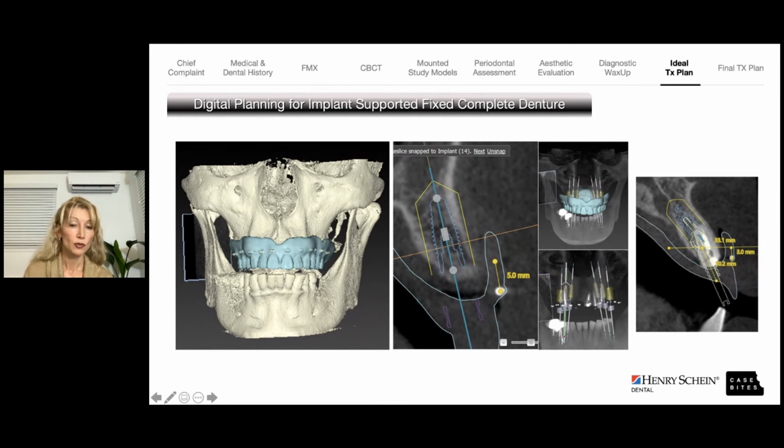And the reason is 2 to 3 millimeters for the soft tissue above the implant, and then another 2 millimeters for that restorative material, the pink material, just to give us a little bit of a cushion in terms of the patient showing any margins at any point. So now that we have that information on a CT scan, we can plan our implant depth, which is a very important part of implant planning.